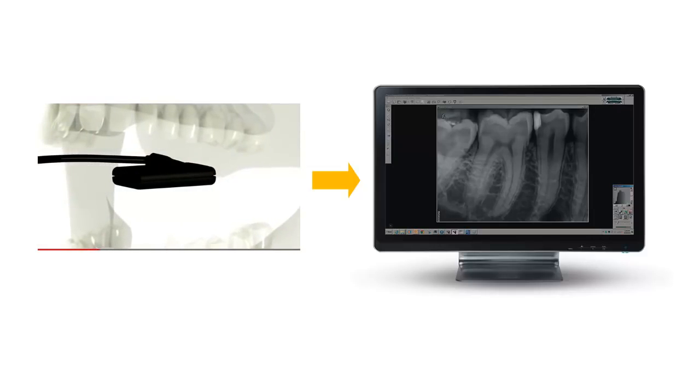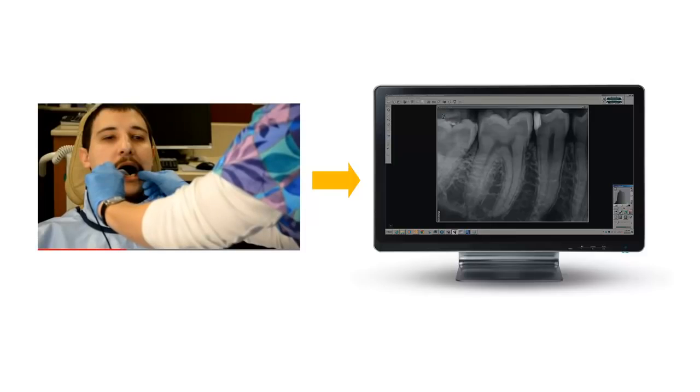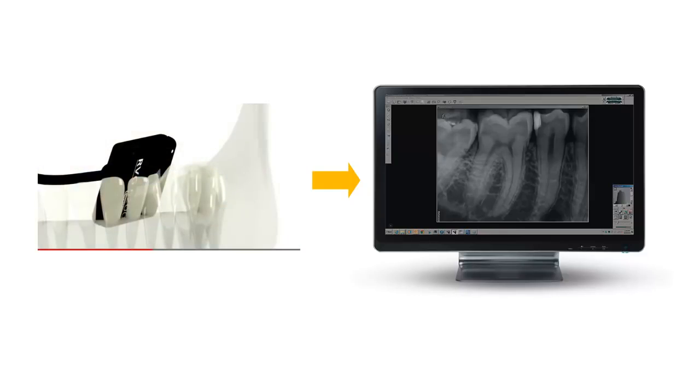Because the image is processed automatically, it is displayed in the software instantly, so you no longer have to wait for film development. With the RVG sensor, simply position, expose, and view your images.